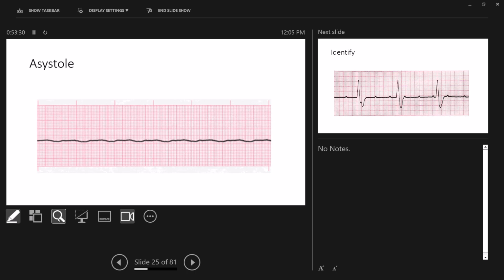Yeah. So as you're looking at this, with asystole, we're thinking a nice little solid flat line. This is all artifact in here. Okay. Artifact meaning it could be the patient's sweaty. It could mean that there is hair there. Could mean that there's a lot of adipose tissue on the patient's chest. This is definitely not electrical activity. So this is indeed asystole.